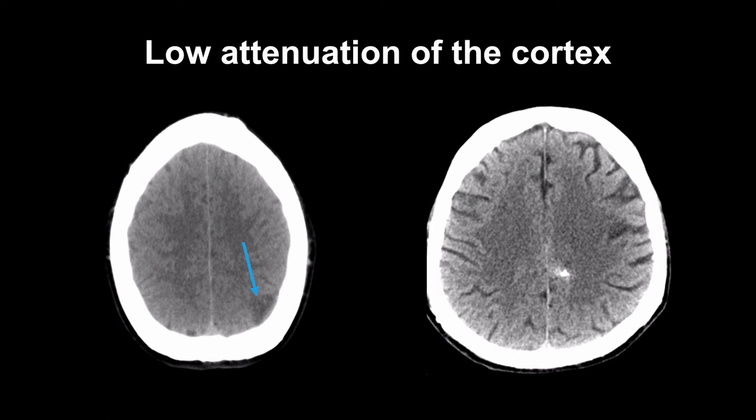But once you know that the patient had symptoms of right-hand weakness, you're more likely to find it. The low attenuation evident in the cortex in this patient proved to be reproducible on multiplanar reconstruction and lies within the left precentral gyrus, precisely where hand motor function resides.